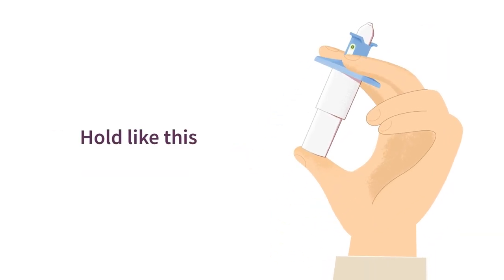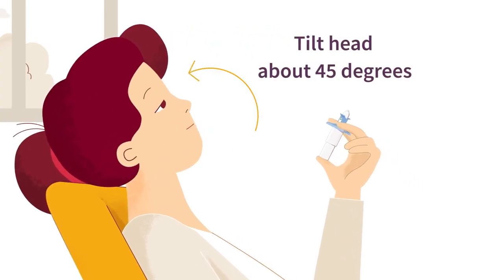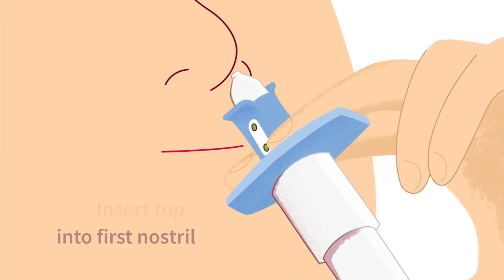Now hold the nasal spray as shown, with your thumb gently supporting the plunger. Be careful not to press the plunger just yet. Tilt your head back at about 45 degrees throughout the administration. This will keep the medication inside your nose.